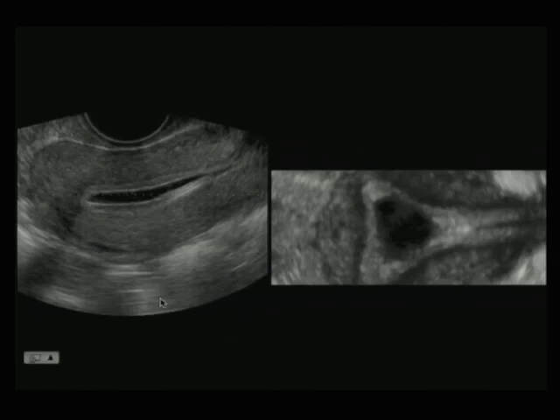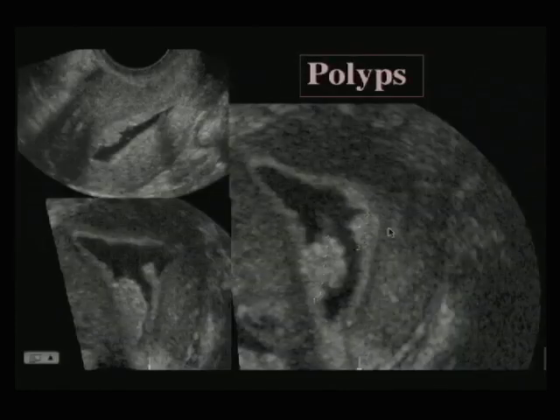Once you have that view, you can take a look at it live, which is, in this case, we've got a split screen going where we've dropped down a little perpendicular line that is at right angles to the screen and displayed what we can see here, which is a coronal aspect of this uterus filled with fluid, and this is in the reconstructed plane.